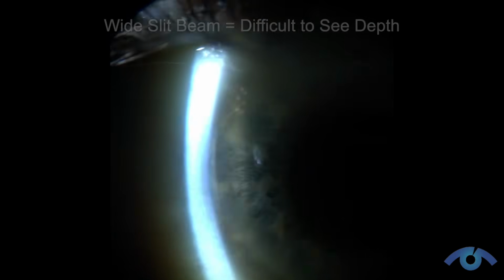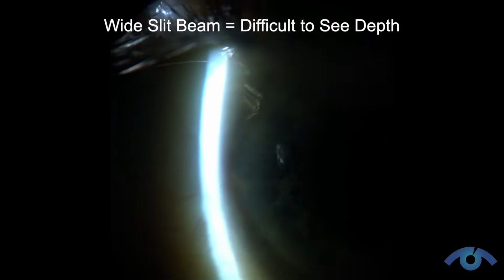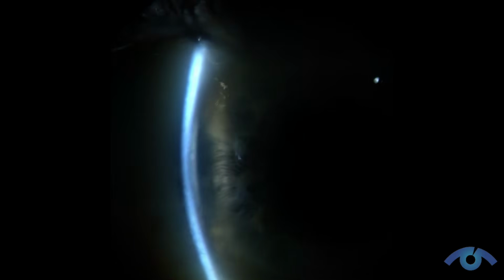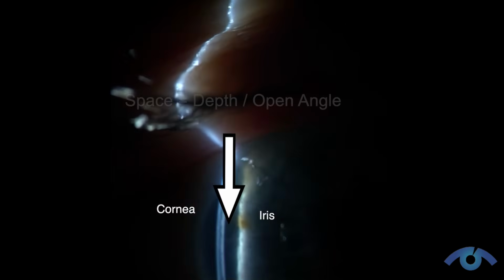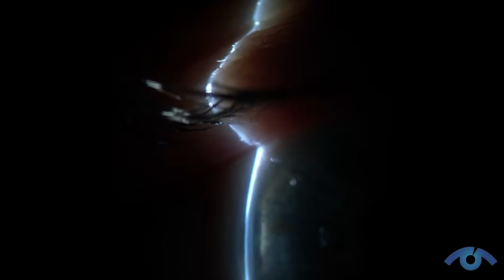So in this video, again, you can see a wider slit beam, not really demonstrating the distance or the depth between the iris and the cornea. As you narrow it down, you can see as you hit the cornea, you get layers in that first cross section where the light is, and you get more depth. Here again, with an open angle, you can see the same thing.